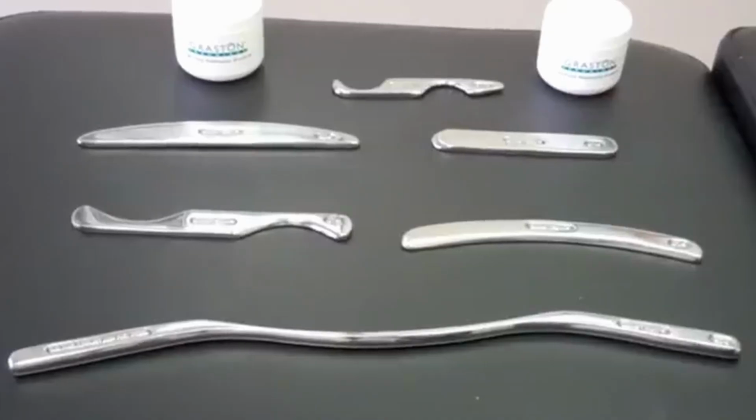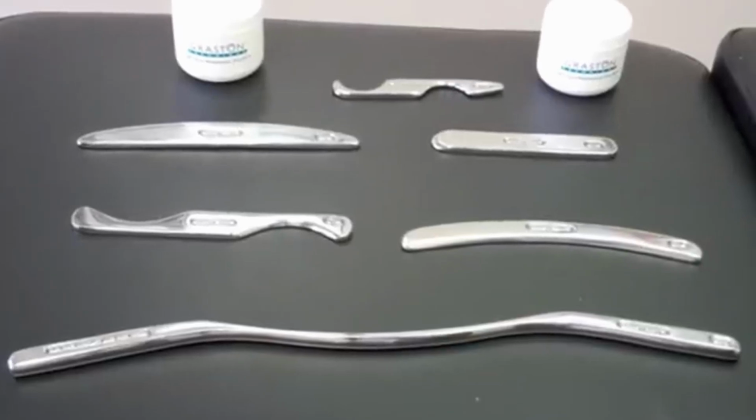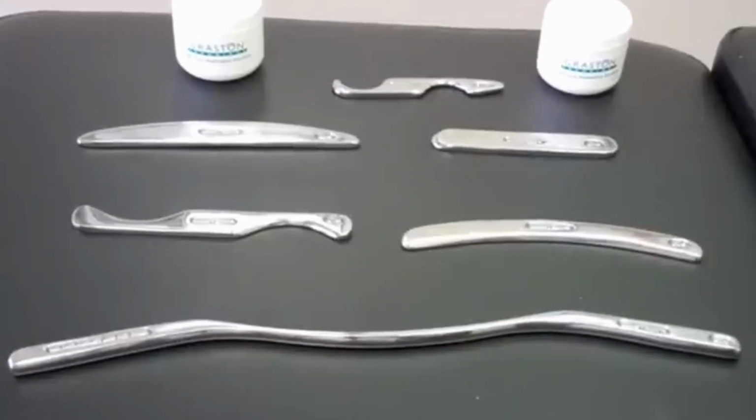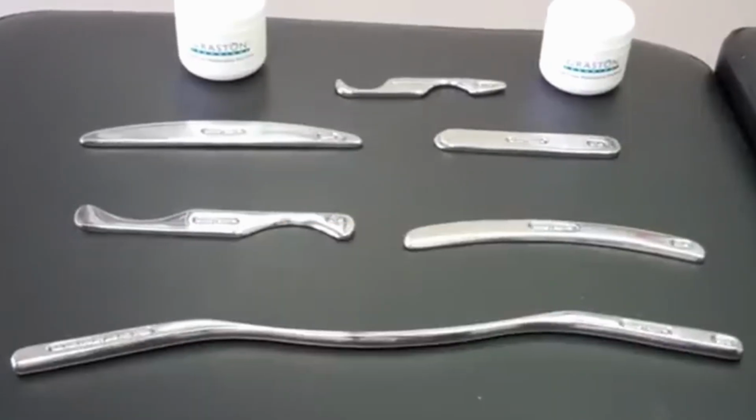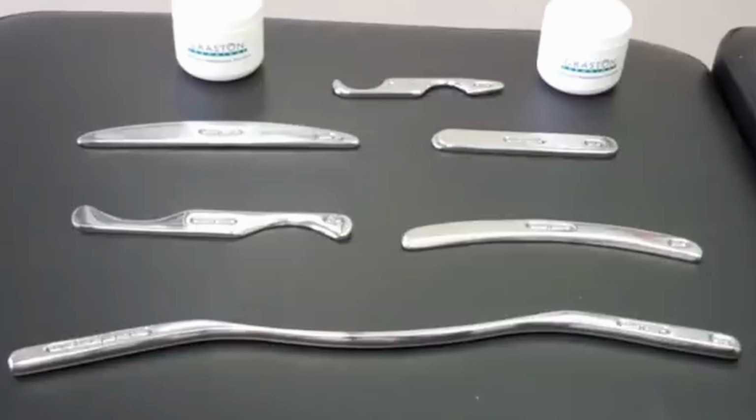If an area needs more specific work, a smaller instrument's used. The instruments come in all different shapes and sizes for different injuries and different parts of the body. The Graston technique is great for a variety of conditions, but to name a few: neck pain, low back pain, IT band syndrome, plantar fasciitis, rotator cuff issues, and carpal tunnel syndrome.